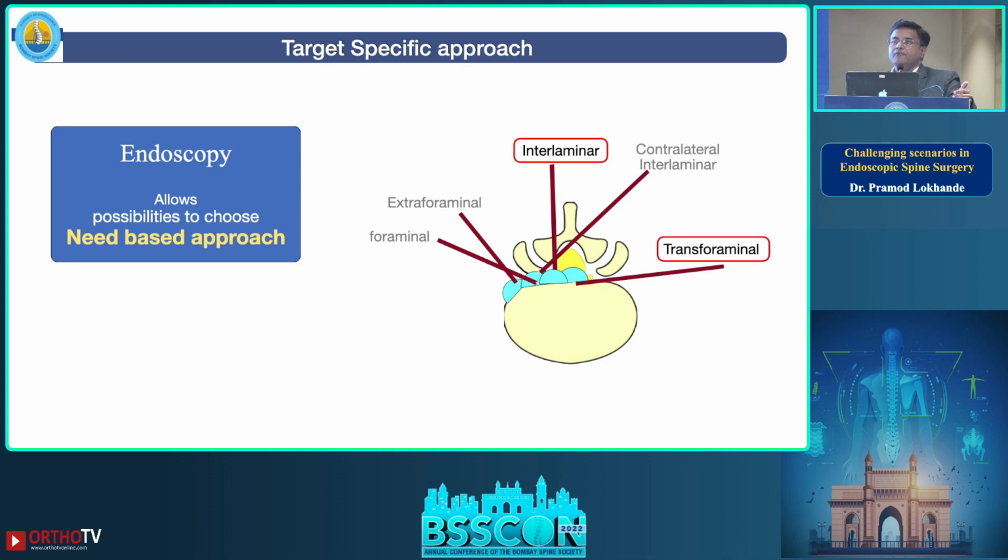And this is possible because it provides a target specific approach. We have different approaches, two of which you know already, interlaminar and transforaminal. And all this is to avoid the bones and avoid the vital structures to reach the pathology and to treat the pathology with minimal damage.